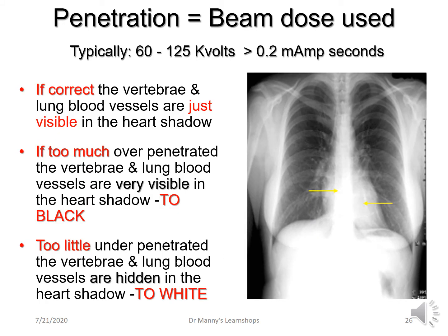Penetration is another technical aspect. Penetration basically means how much beam or dose of radioactivity or wavelength has been used by the radiographer. Typically the dose is 60 to 125 kilovolts at a speed of 0.2 or greater milliamp seconds.